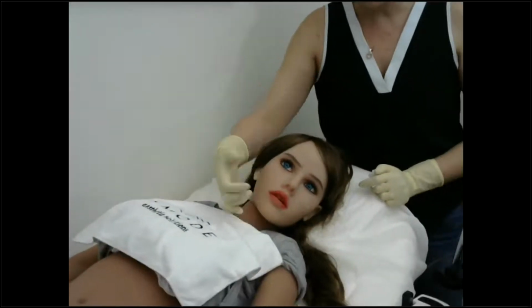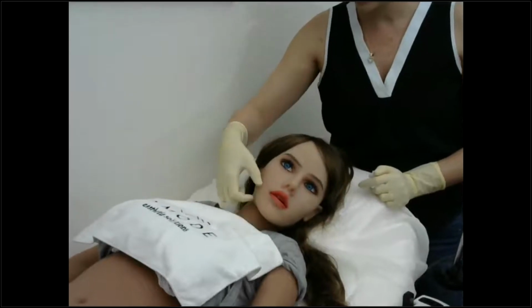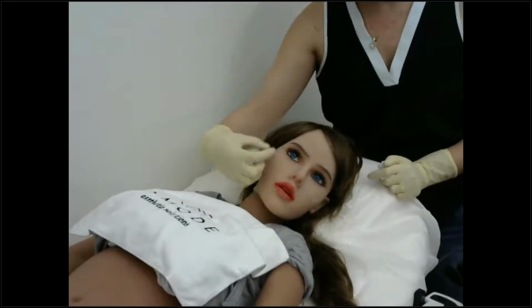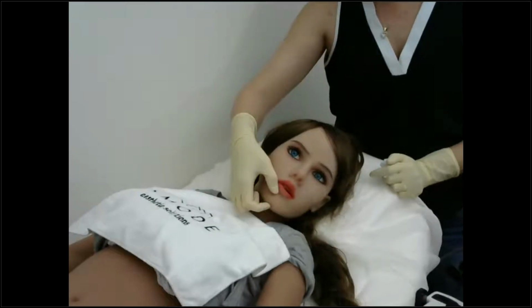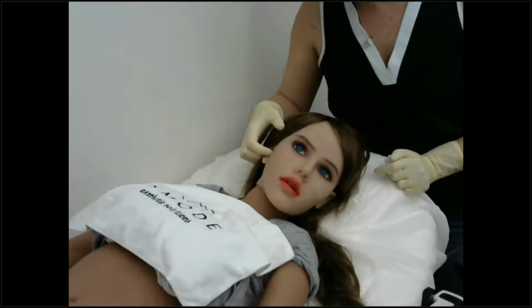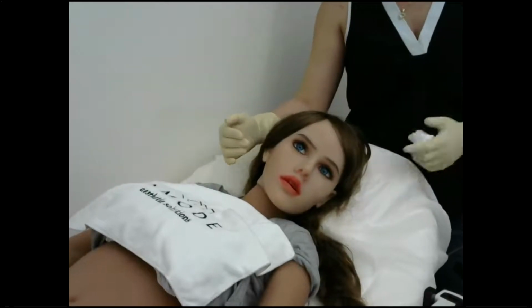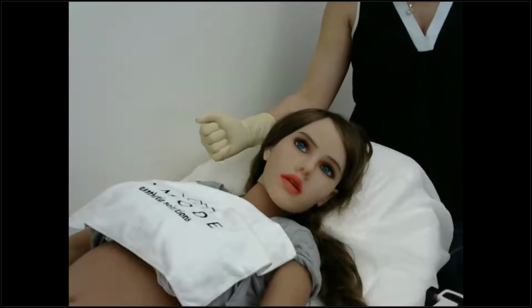As I said, we have two types of division for zones. We can do either that way or dividing it that way. Personally, I feel this is more physiological, more anatomically correct. So that's what I will do. I will not demonstrate marking her because it will damage her. So forgive me for not doing that.